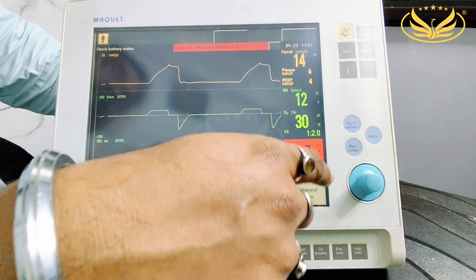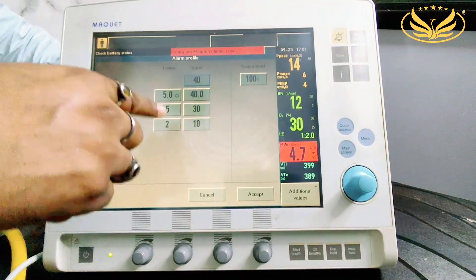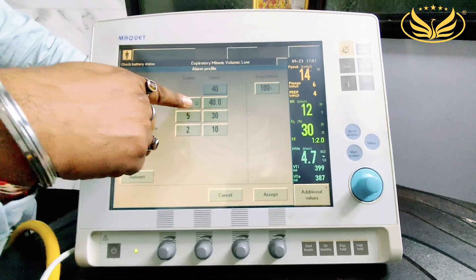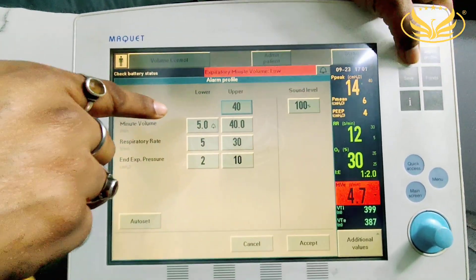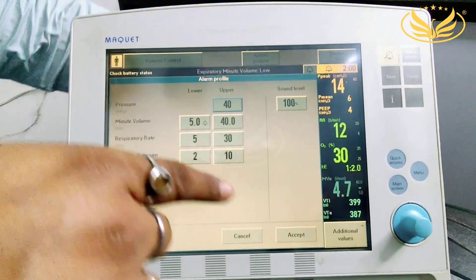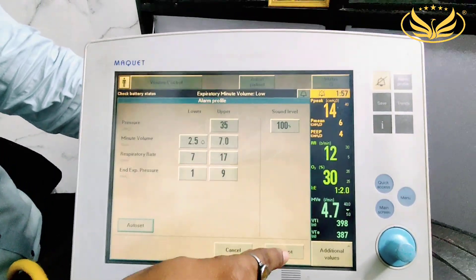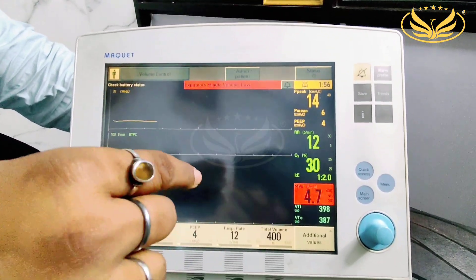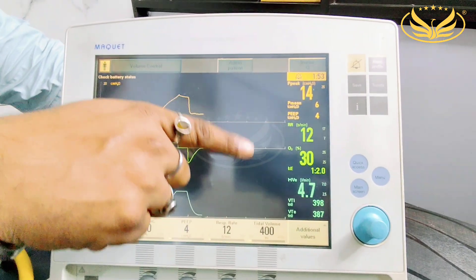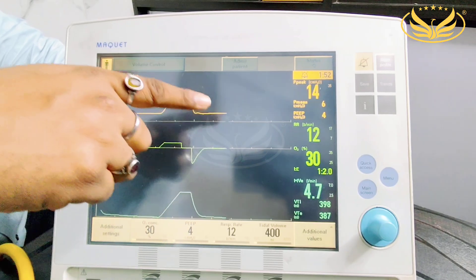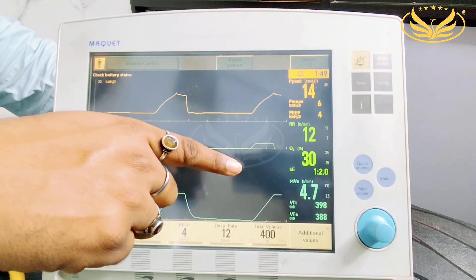In that case, what we have to do is open the alarm profile. From here we can choose alarm upper limit and lower limit. If we do auto-set and accept, all parameters will get set automatically — the upper limit and lower limit will be set automatically. You can also manually set whatever upper or lower limits you require, or choose auto-set so it gets set automatically.